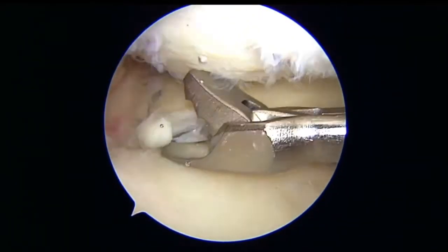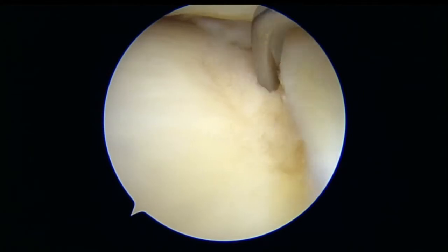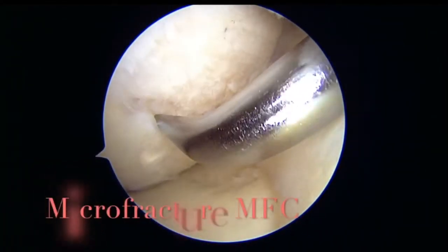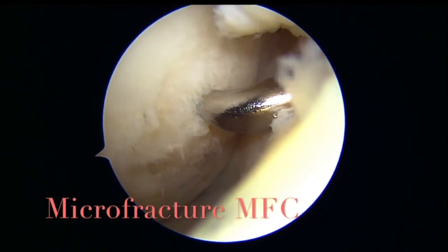We can chip off the small flap of the meniscus there. Now it is nice and taut and it is covering the tibia as well. We go ahead and do the microfracture as well over the medial femoral condyle where you can see the bare area on the medial femoral condyle.